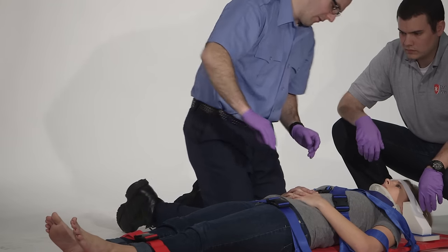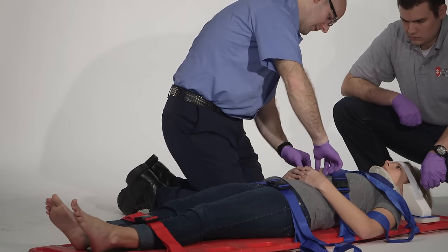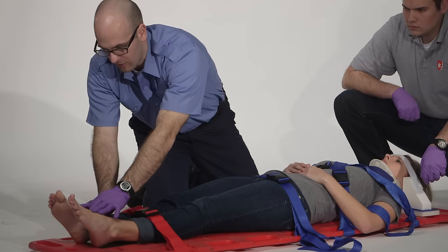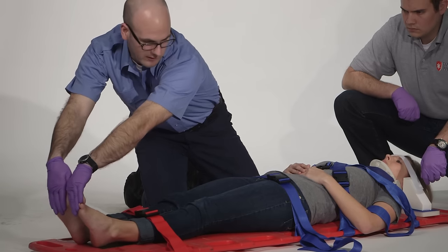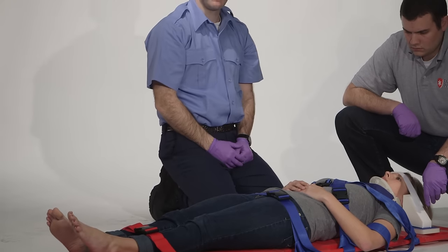The patient is secured to the board. Now I will reassess CMS. Good pulses. Can you squeeze my fingers? Can you tell me which fingers I'm touching? My thumb. Moving down to the feet — good pedal pulses. Can you tell me which toe I'm touching? My big toe. Can you push down against my hands? Pull back up against them. Pulse, sensation, and motor function are present in all extremities.